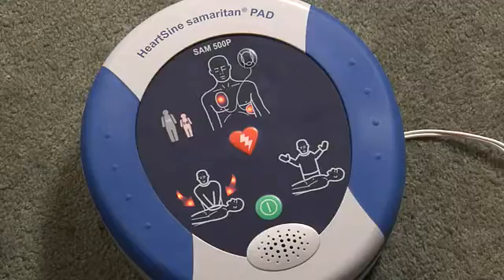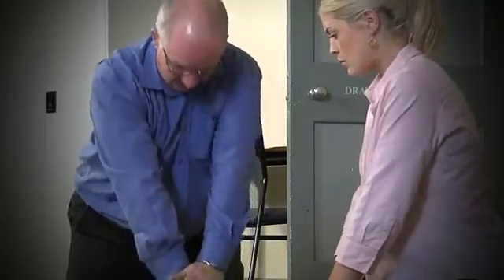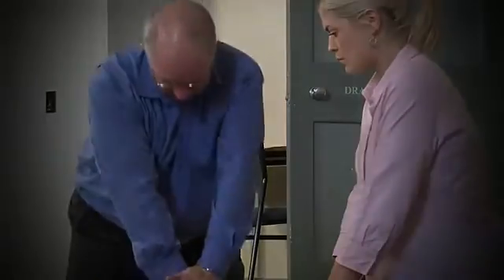Good compressions. Push faster. It gives feedback on the speed and depth of compressions. These real-time prompts, based on actual blood flow through the heart, ensure you are performing effective CPR.